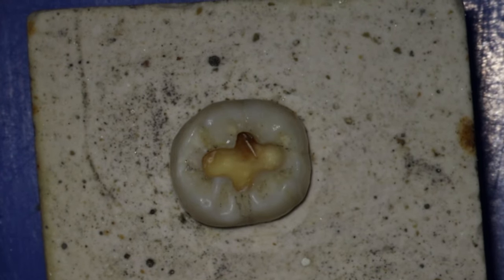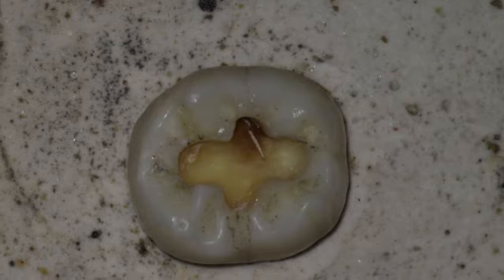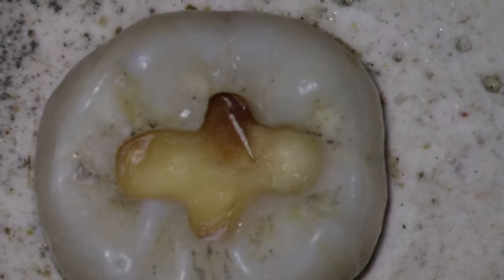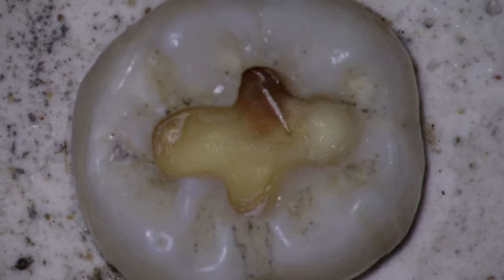So this we are trying to learn under the microscope, so I will take you for a higher magnification so that you can appreciate it better. This is the maximum magnification, which is really helpful for caries excavation and endodontics. So I will keep it here so that you can clearly understand.